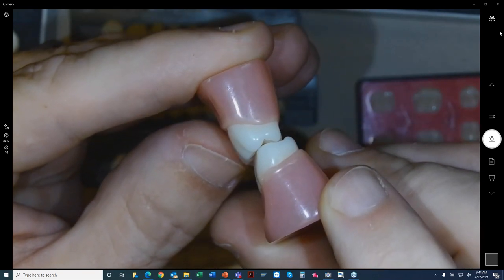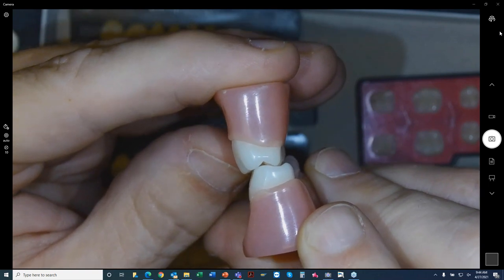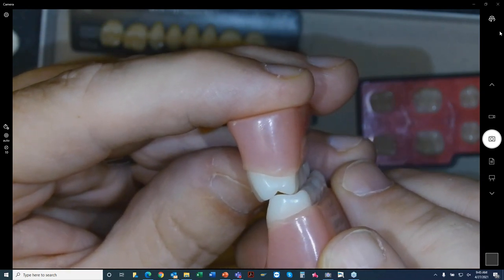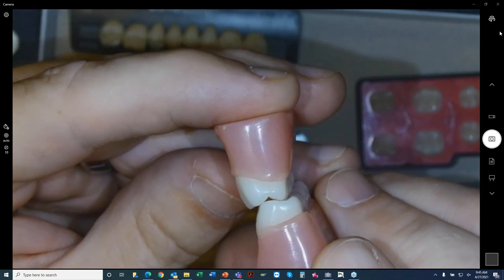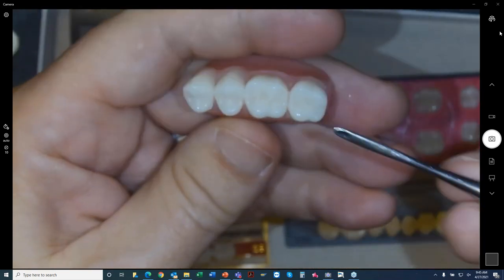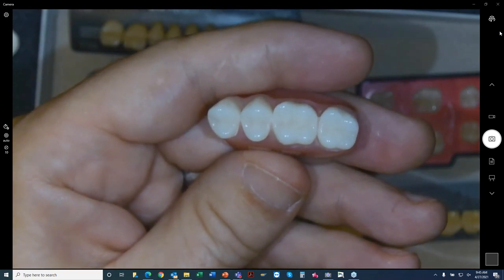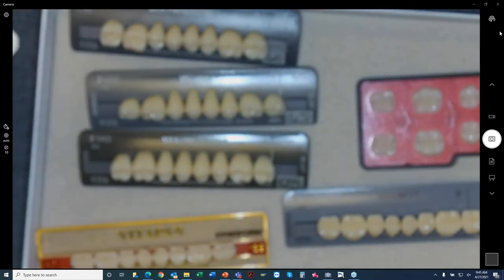That's how these are designed and formed on the posterior teeth, to allow that little bit of movement so you don't have a locking in of those teeth, and the patient feels like they're sticking all the time. And if they stick, they lock in. As the jaws separate, the dentures are more easily flipped. So this kind of design will help the patient chew more efficiently, and they feel more comfortable, with a little bit less soreness, because there are no pinch points, there is no locking of those upper and lower posterior denture teeth.